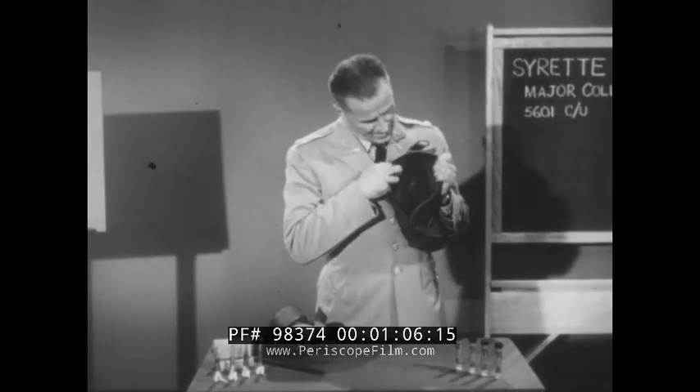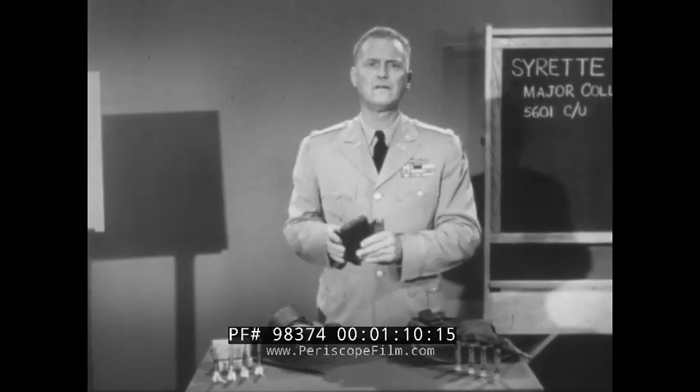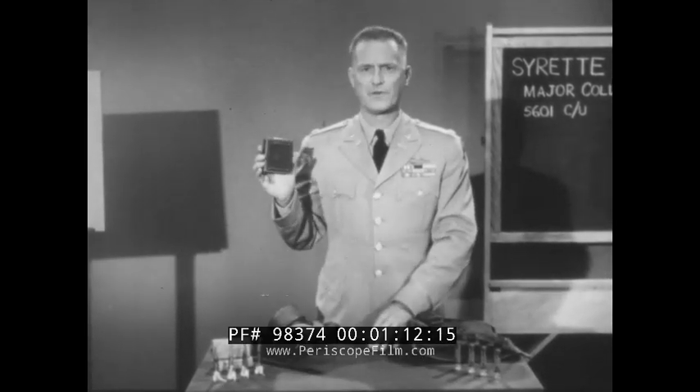In your protective mask carrier, you will find this metal container. It's called Protection and Treatment Set Chemical Warfare Agents M5A1. The set was originally designed to contain four tubes of ointment used in decontamination and protection against blistering war gases. Now that nerve gases are with us, you will find instead of one of the tubes of M5 ointment, this plastic container.